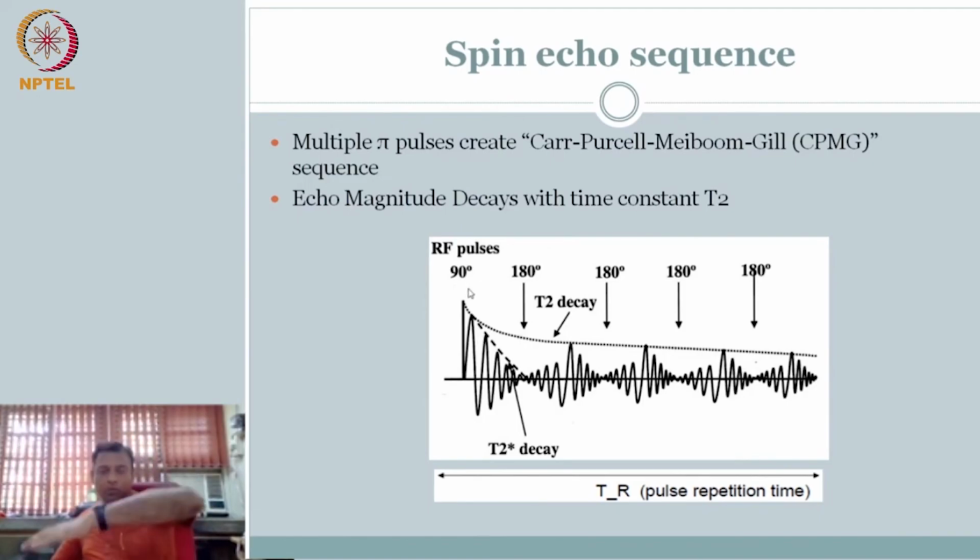So I can do one pi by 2 and flip it left, right multiple times. I know that the signal is decaying due to T2. So after 2 or 3 times the T2 value, no matter how many times I flip it, or apply 180 degrees anytime, the signal is going to be very weak, right? It is going to be very weak because the transverse component is lost. Your T1, your MZ is increased. So after some time, it is not worthwhile flipping it left right because it is inherently poor signal.